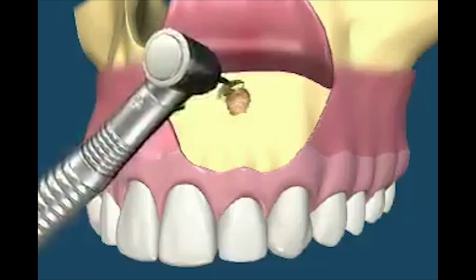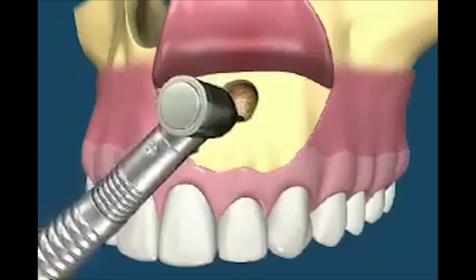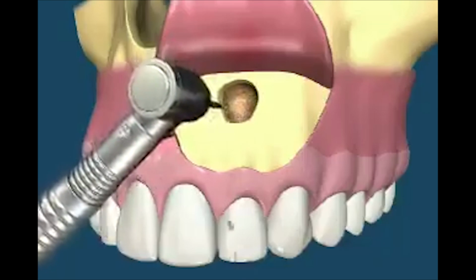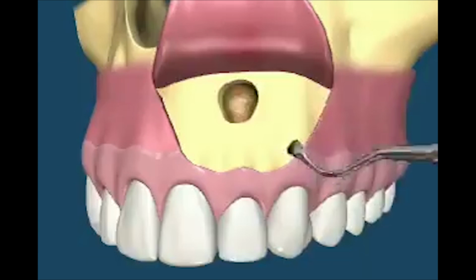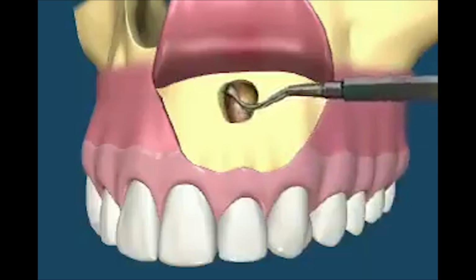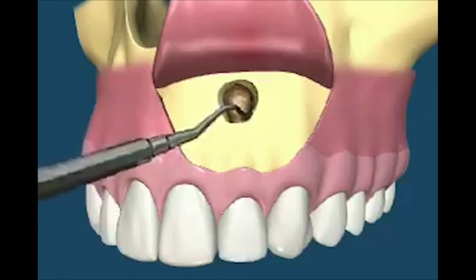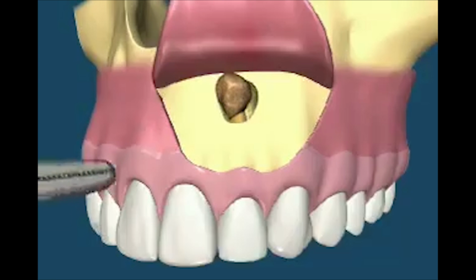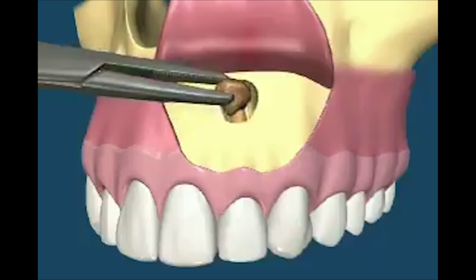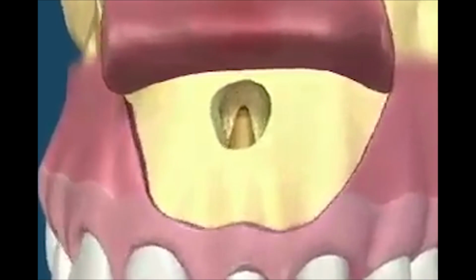There are special small drills to help the dentist or root canal specialist to perform this microsurgery. The pathology at the tip of the root is then removed. Here we carefully remove a cyst that has formed and grown to significant size. If the size of the area is large, surgical correction is mandatory along with root canal treatment.